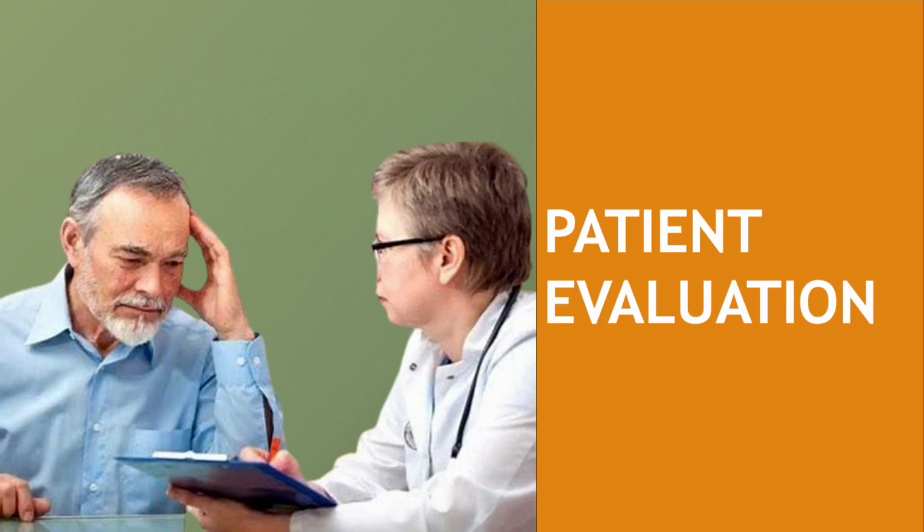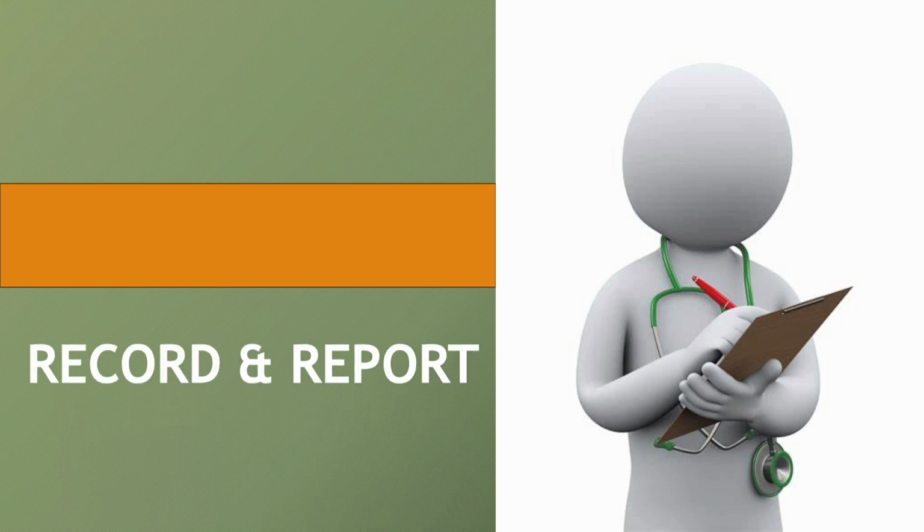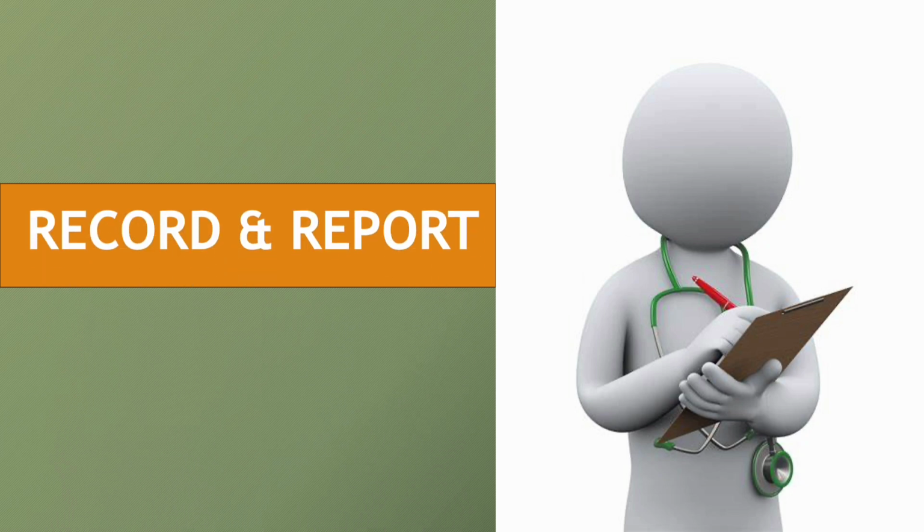To ensure continuity in nursing, make sure that you verbalize the need to reassess the patient at a later stage. This is to allow you to observe for any progress. Once more, make sure that your patient is comfortable. Open the screens. Thank your patient for the time they've given you, and thank your assessors. Record everything accordingly in the patient's file in accordance with the record-keeping principles. And make sure that you report any abnormalities you found to the sister in charge.